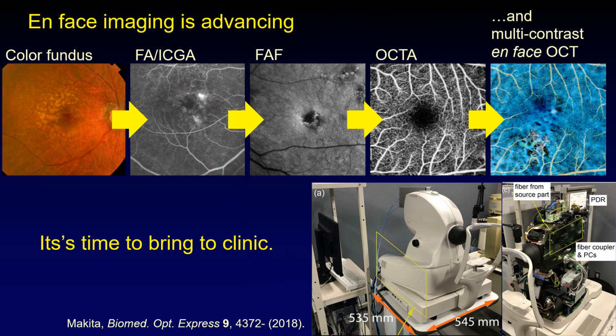So, let me conclude my talk. Here we demonstrated totally motion-free wide field and melanin contrast OCT. It can be used as the fifth generation of the en face retinal imaging modality, and hopefully it will soon be translated to the clinic. Thank you for your attention.